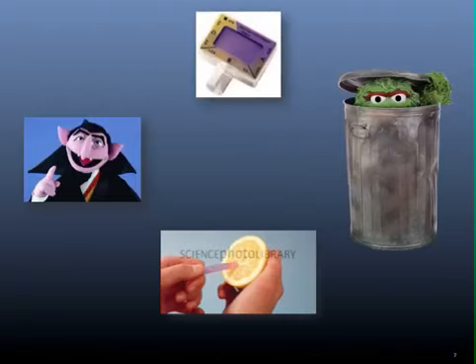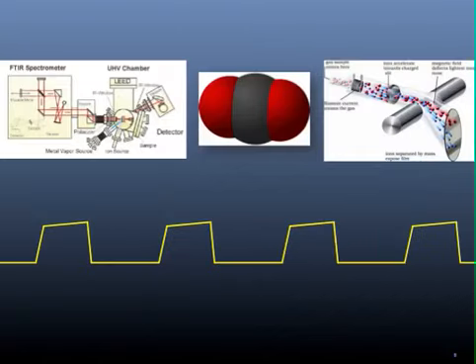One aside, you can still use those colorimetric CO2 detectors to confirm intubation, but if you do, remember that there can be some CO2 in the stomach, so you need to count out 6 breaths and make sure there's a persistent color change after you count to 6. Also, these are just filled litmus paper, so if the airway is soiled with acid, you're done. So once your ED gets waveform capnography, throw these guys in the trash.